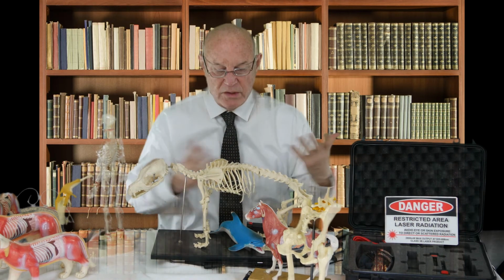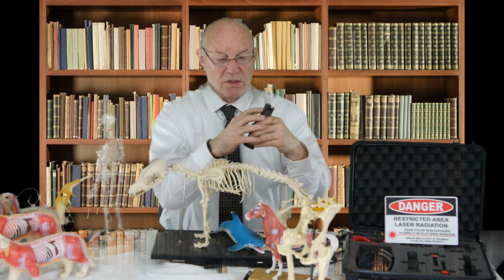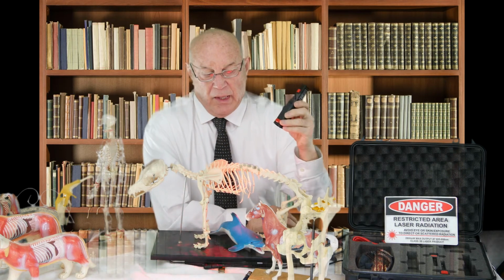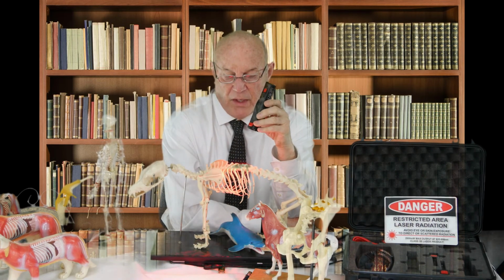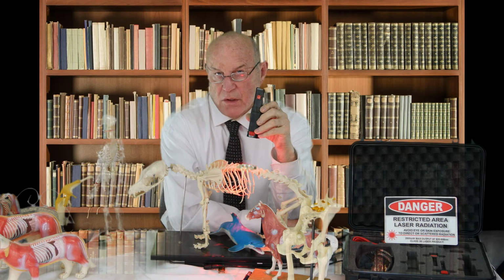Classically we'll see a dog that comes in with acute or chronic paralysis, and we'll treat them with this laser. We'll treat them twice a day for 3 days, once a day for 3 days, and twice a week for 2 weeks. The treatment isn't any more complicated than this. Very commonly the problem is thoracolumbar at T12 to L3, in that area, and so we can give them 60 seconds of this for disc syndrome or paralysis or paresis protocols that we have here.